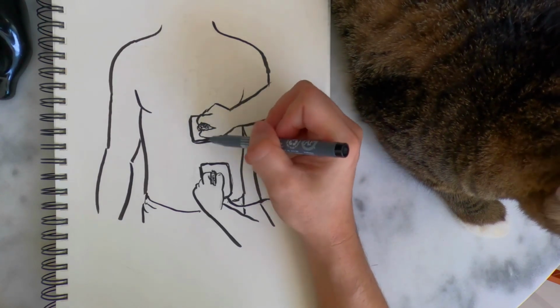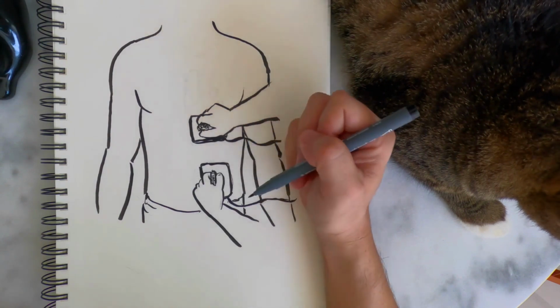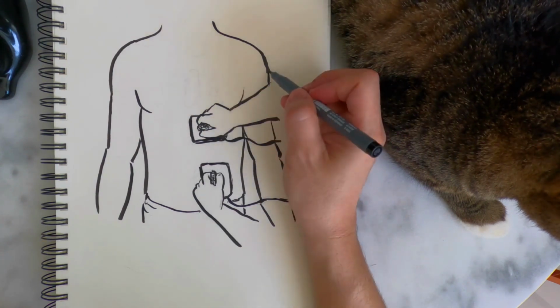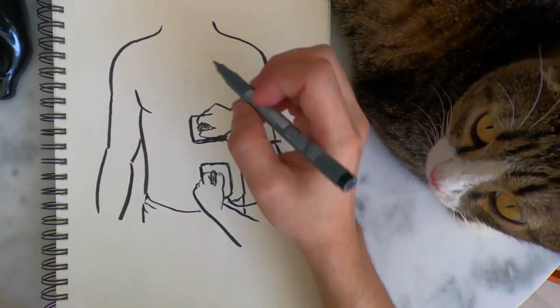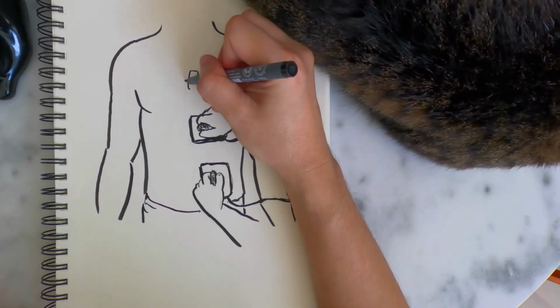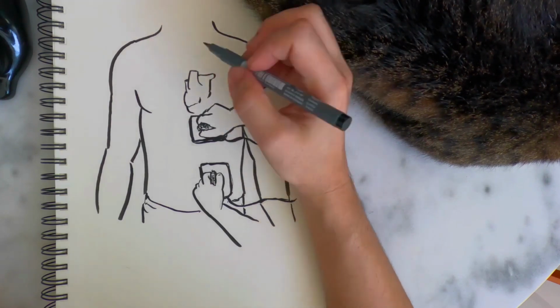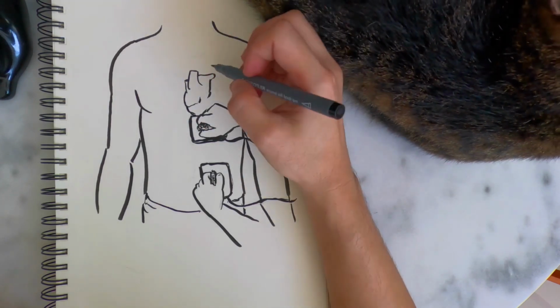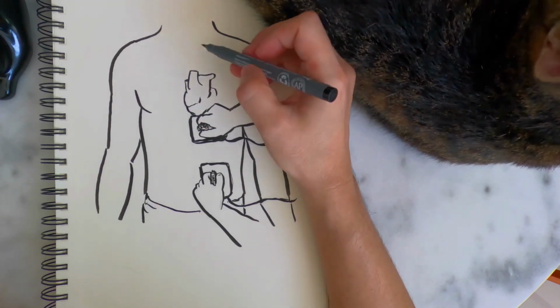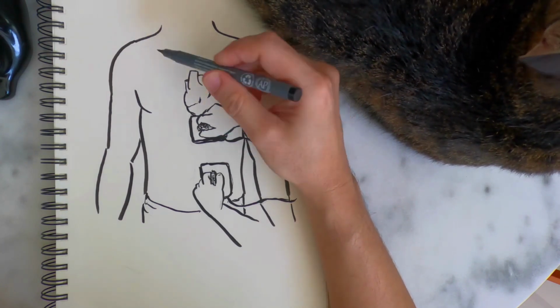I want to explain why understanding how electricity flows and how the device works is crucial. The electricity won't pass through the heart at all. If we place the pads on the abdomen, the electricity won't reach the heart, so it won't be able to shock the heart. If we don't understand the mechanism, we might think it's like being electrocuted. Have you ever seen someone get electrocuted? Or have you experienced it yourself? It affects the whole body.